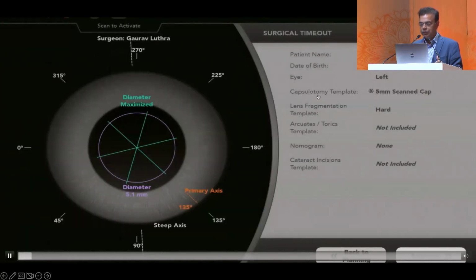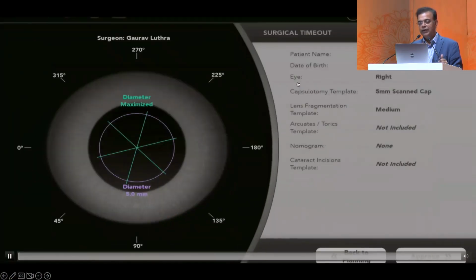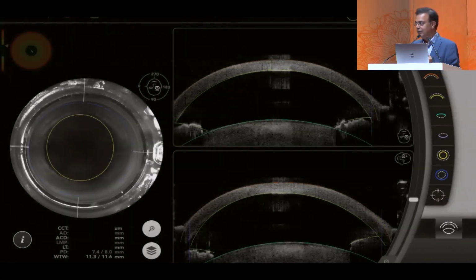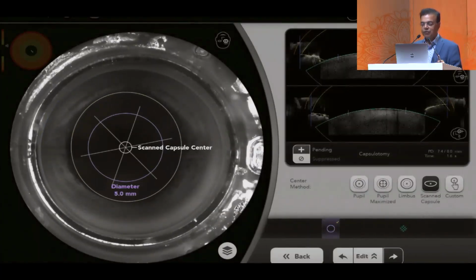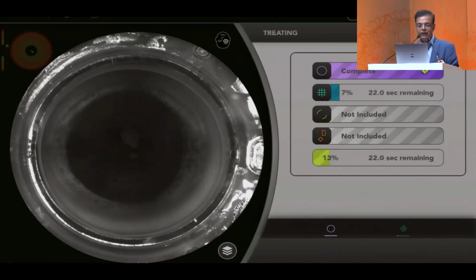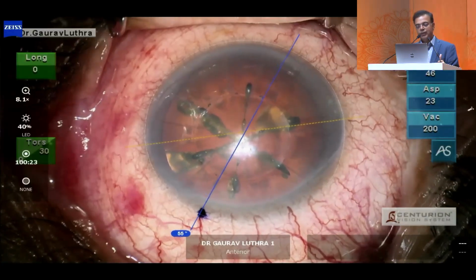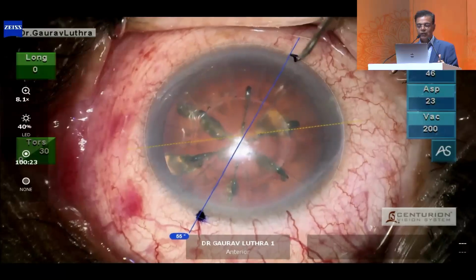Now going on to another technique where again it might seem counterintuitive, because we've been taught right from the beginning that it's not a great idea to use femto assisted cataract surgery for RK eyes, but for me it's a very, very good indication because of many reasons. Usually these are high myopic eyes where the chamber depth is much more than usual. Also there's a chance of the lens iris diaphragm moving backwards once you have switched on the infusion.